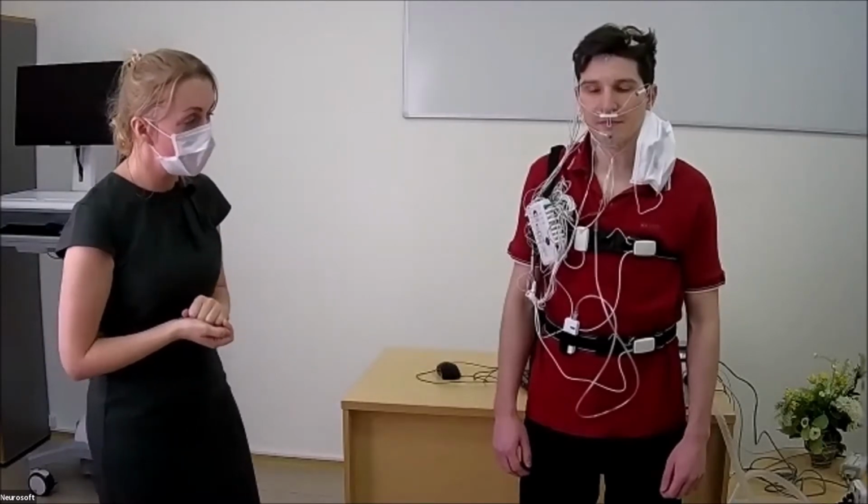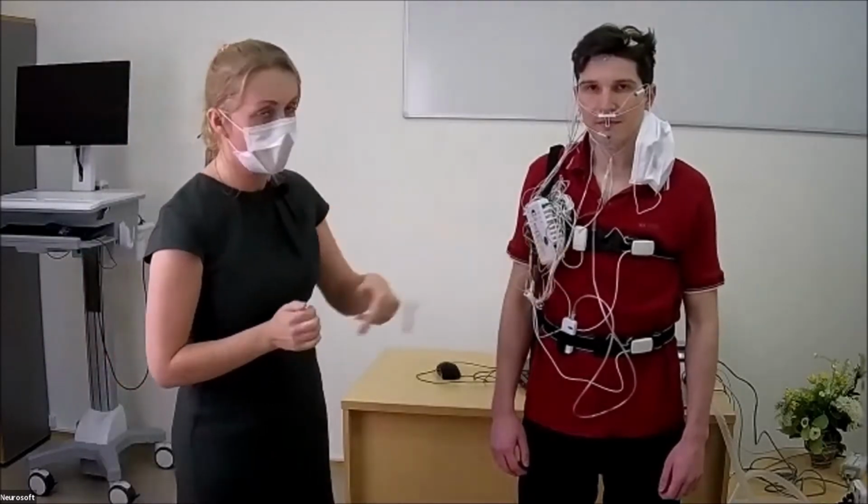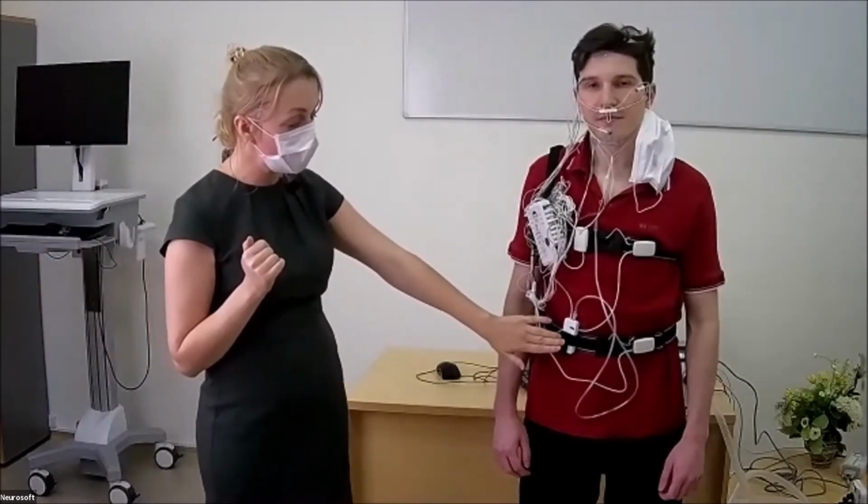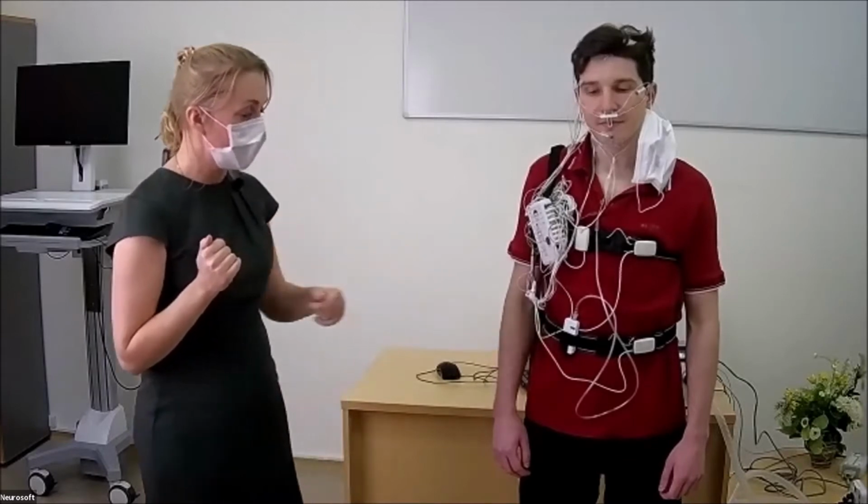We will show you later. Very important to have body position sensors. We fix this sensor on one of the belts, and we put the pressure transducer sensor on the respiratory belt too.